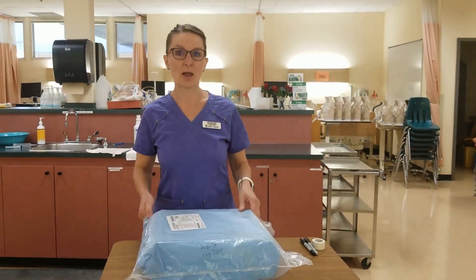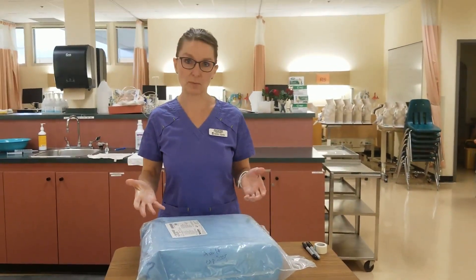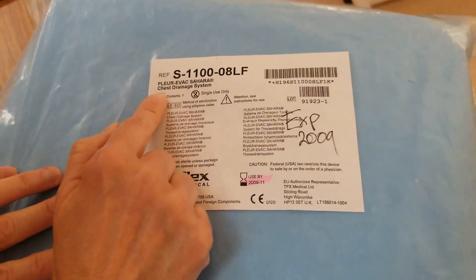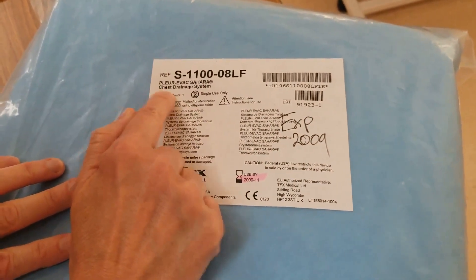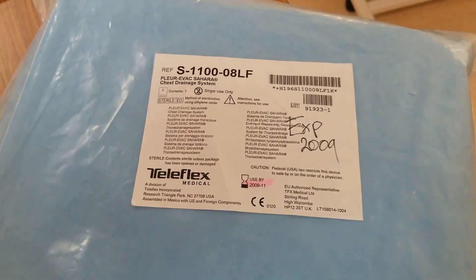Hi there. Today I'm going to show you how to set up a chest tube drainage system. When looking at your chest tube drainage system, you want to get a Plurivac chest tube drainage system, and that's exactly what I have.